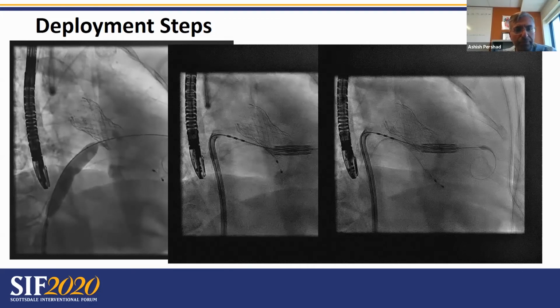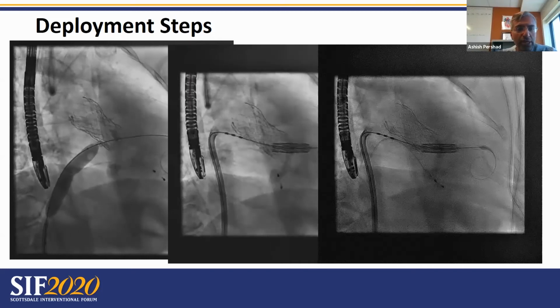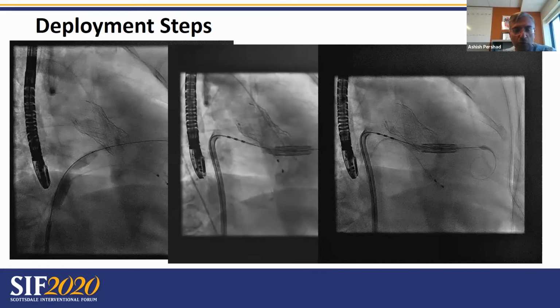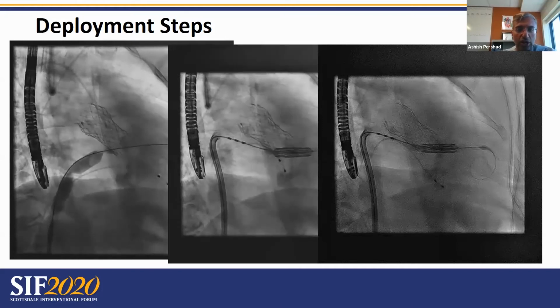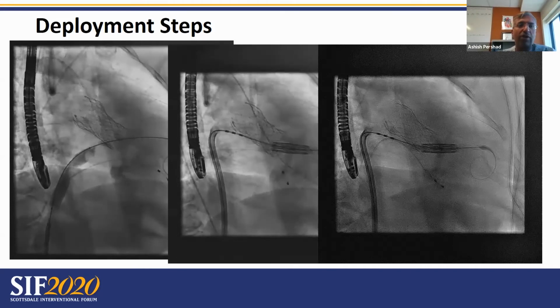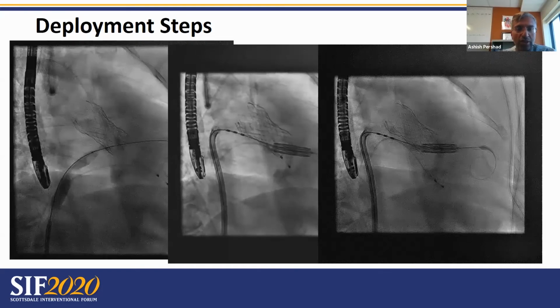Once we've done that, we are able to cross into the left atrium and then into the mitral valve using an Agilis sheath. And once you have an Agilis sheath directing you, use a JR4 and an exchange length 0.035 wire to cross into the left ventricle, and then switch the 0.035 exchange length wire for an extra small Safari wire. The bend on the extra small Safari wire is the opposite direction to what you would normally have, say, if you were doing a TAVR procedure. And we do these procedures with the placement of a temporary transvenous pacemaker, as you can see.